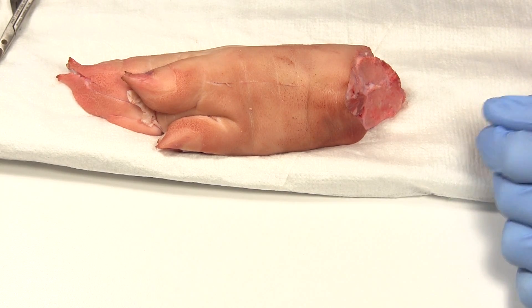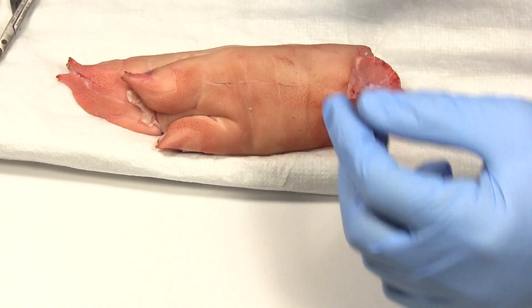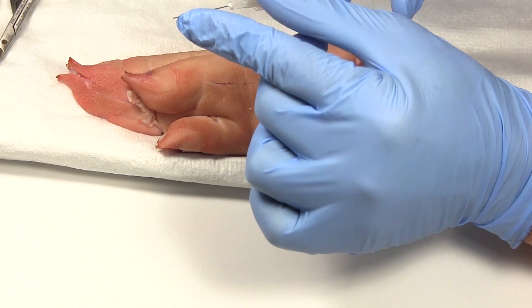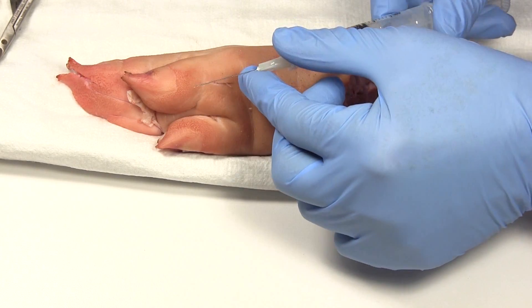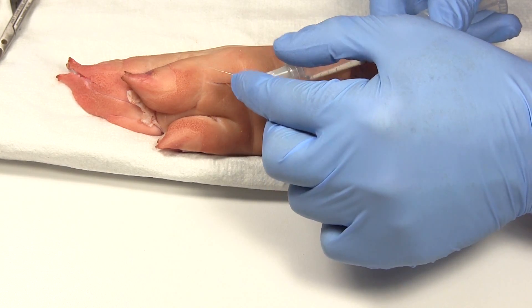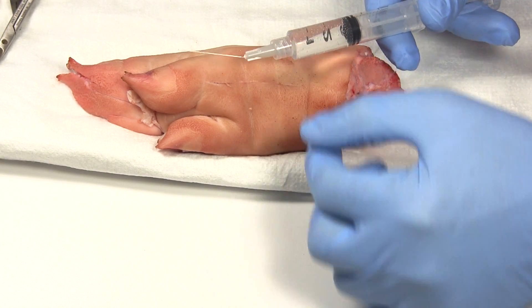First you need to get the area numb. Something I do with the needle that I've learned over the years: I will bend it. You want to go bevel up — the bevel is the hole on the needle, usually angled just a little bit — and I bend the needle just about 10 to 15 degrees. Doesn't have to be a lot, just about that much.